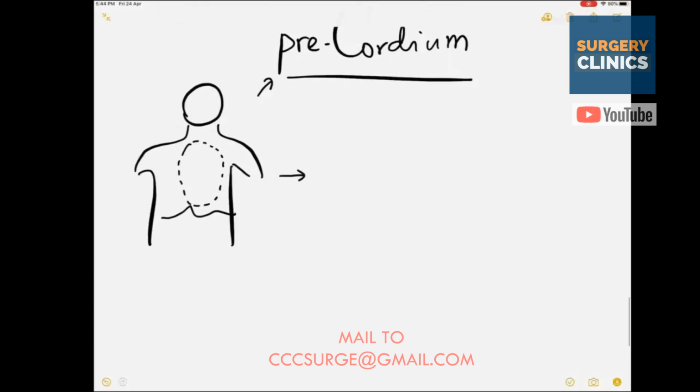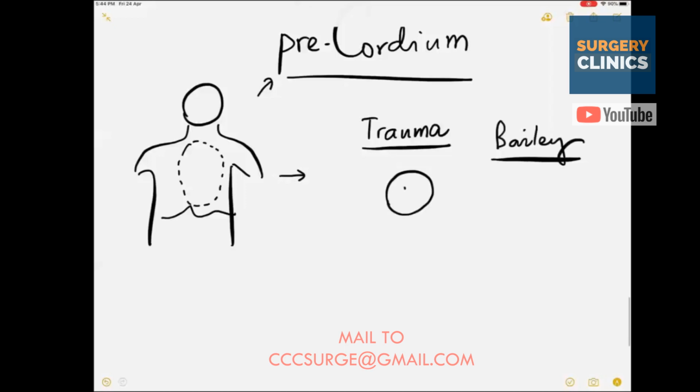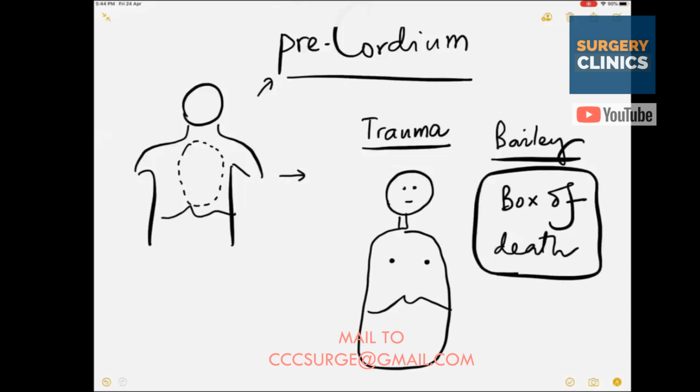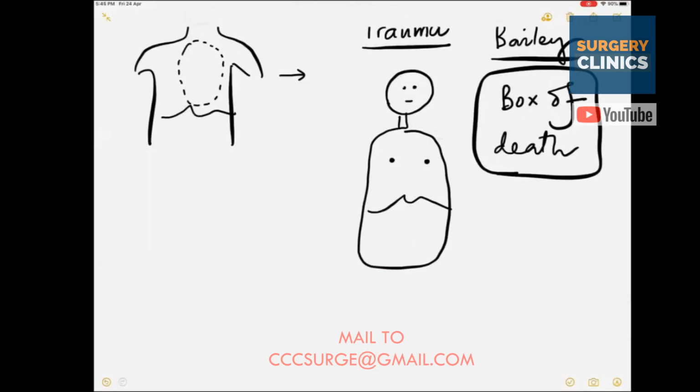Whereas on the other side, in trauma or accidents, if you read Bailey and Love, there is an area called the box of death. You expected a box of chocolate. I know that you are getting hungry. It's not a box of chocolates, it is a box of death. What is this box of death? Very easily, this is the umbilicus. This is the two nipple lines.